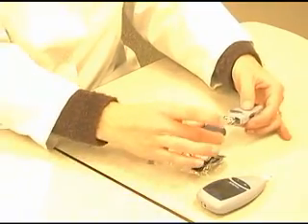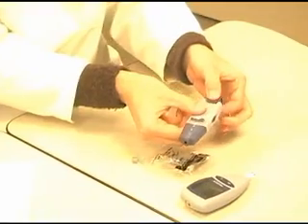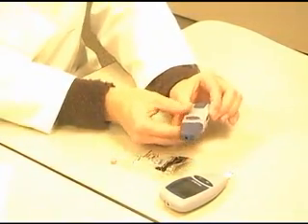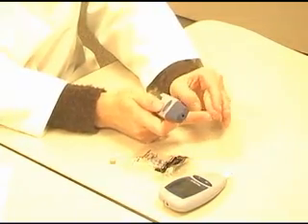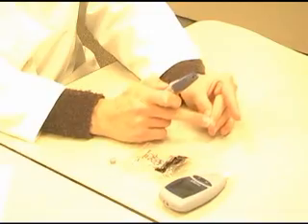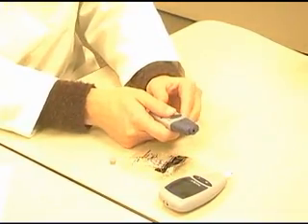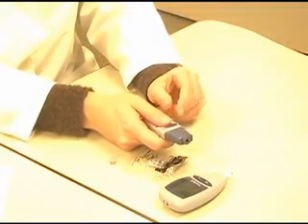Carefully put the cap back onto the device and pull back the blue tab to make sure the device is ready to lance your finger. Then you are going to select a finger, and I suggest a non-dominant finger on maybe the side of it, like right here. You are then going to press this blue button, and you'll hear that noise, and you'll feel a slight poke as the needle pierces your skin.